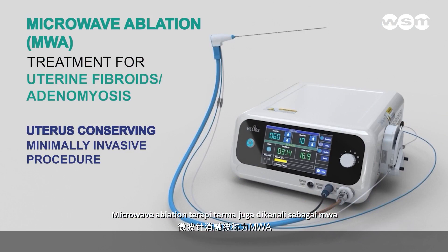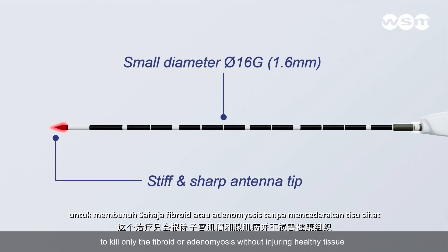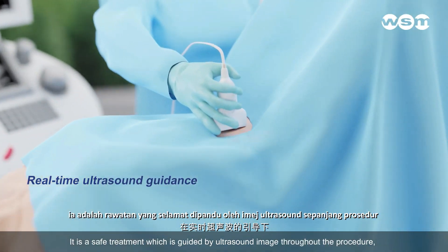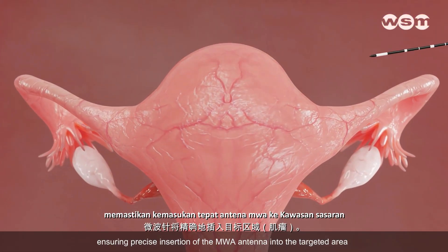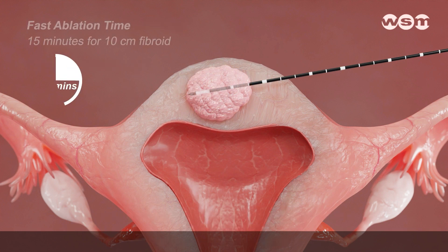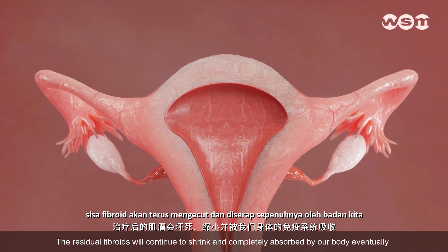Microwave Ablation Thermal Therapy — also known as MWA — is a uterus-conserving technique. With a tiny microwave ablation antenna, it kills only the fibroid or adenomyosis without injuring healthy tissue. MWA for fibroids or adenomyosis can be performed by abdominal approach. It is a safe treatment guided by ultrasound imaging throughout the procedure, ensuring precise insertion of the MWA antenna into the targeted area. MWA uses heat to kill and necrotize the fibroid tissue and shrink the fibroid without cutting or removing the uterus. It is a very fast procedure which can be completed in about 15 minutes. The residual fibroids will continue to shrink and be completely absorbed by the body eventually.